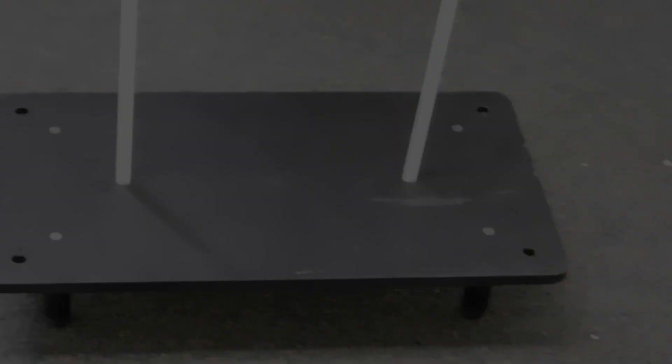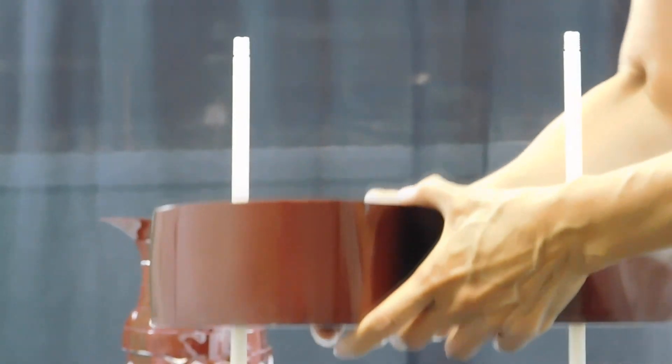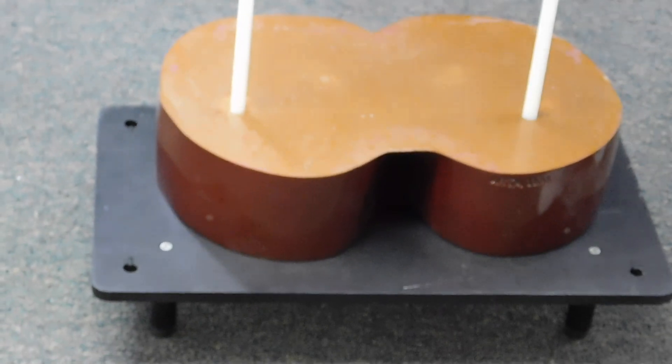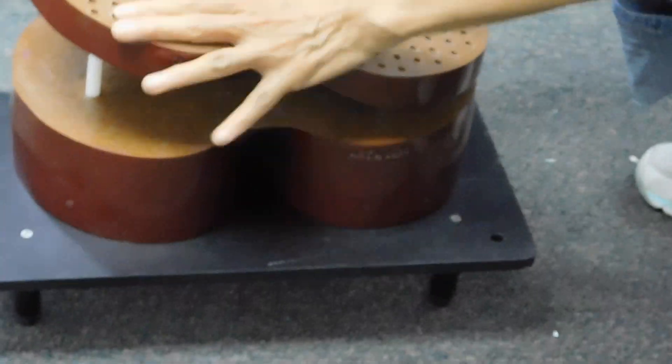Start with the base section at the bottom and align the nylon rods into the holes. Then, stack sections 34 through 11, beginning with the highest number, working backwards.